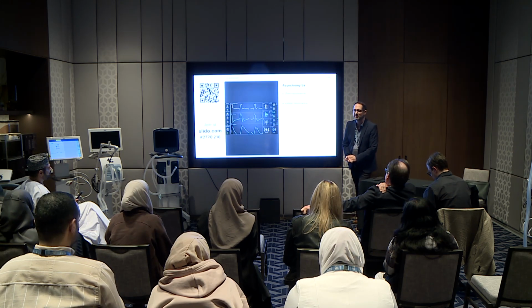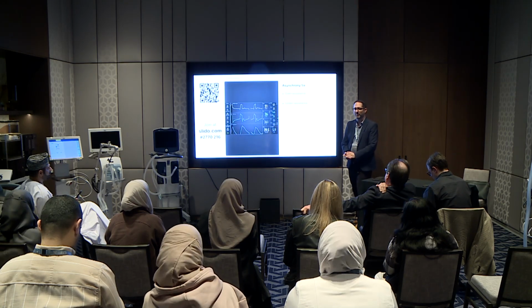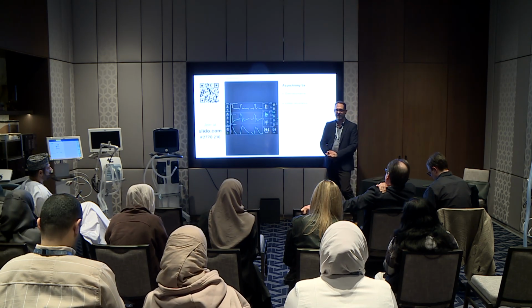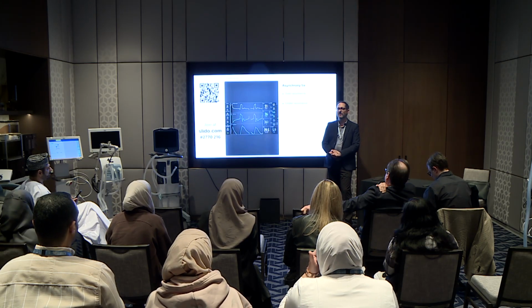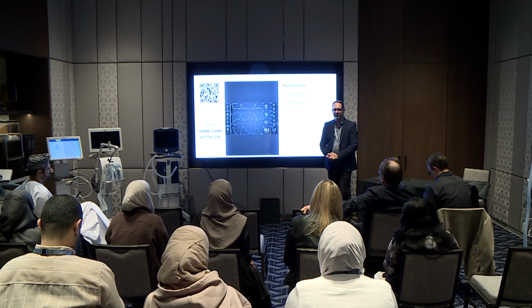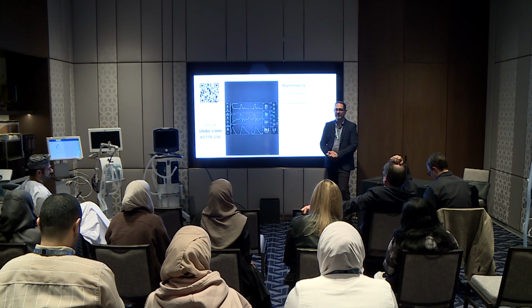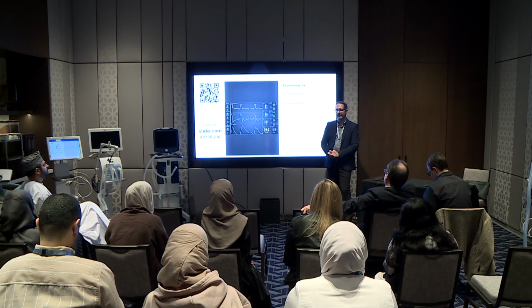This one looks similar to the last one. There are subtle differences. And again, if you had esophageal pressure on this ventilator or EDI or whatever, there would be no question as to what type of asynchrony. So although I'm trying to teach you to recognize it with pressure and flow, the gold standard is to have some form of monitoring like esophageal pressure or EDI.